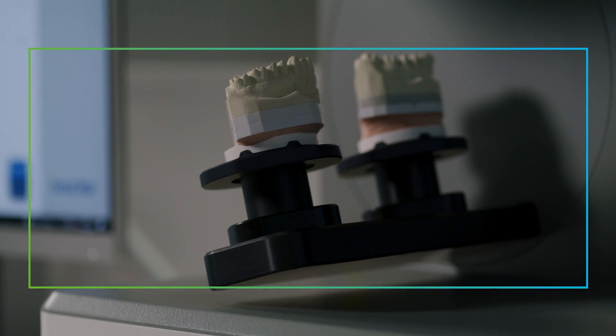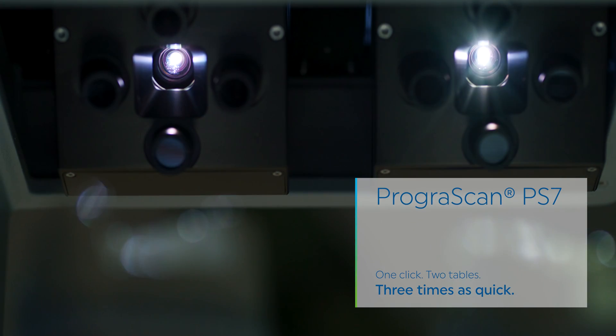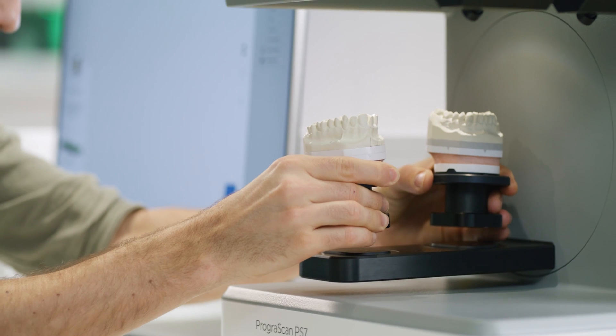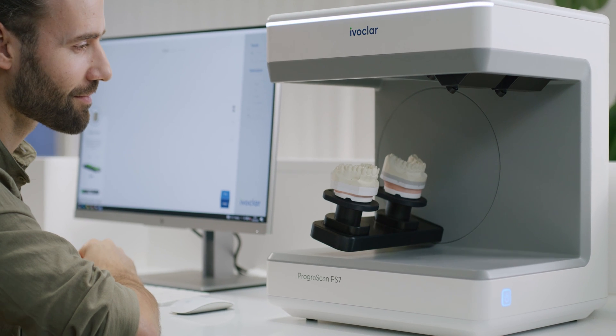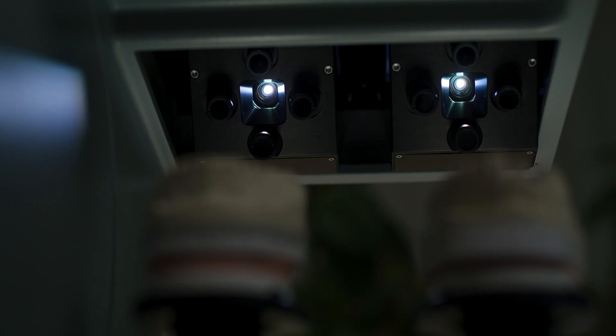This is our first high-end lab scanner that scans upper and lower jaw models simultaneously — the new Prograscan PS7. Equipped with two scan tables, two optical light units and eight cameras, the scan job can be started with just one click.